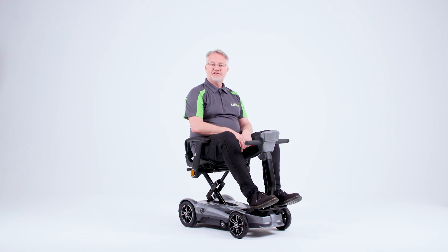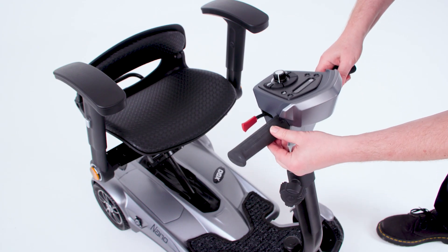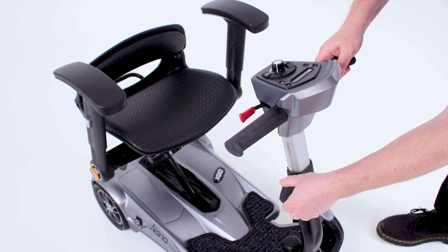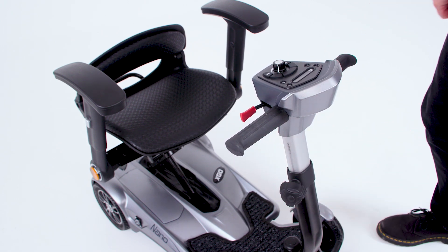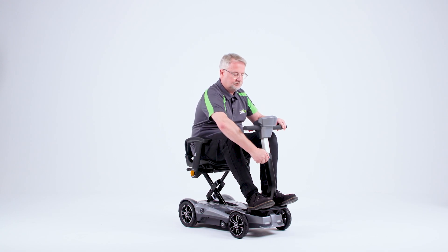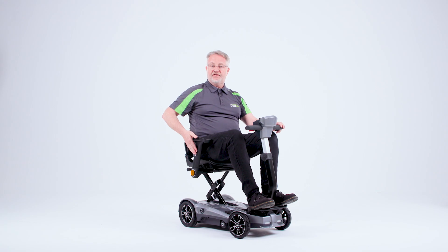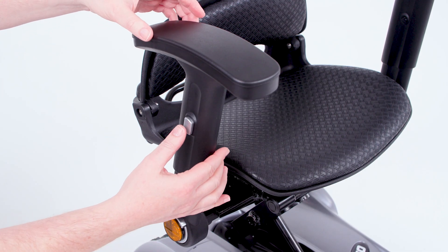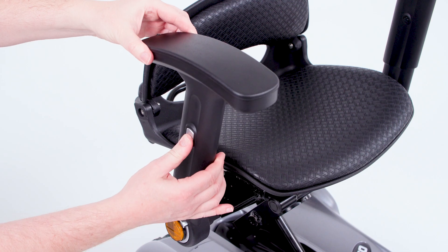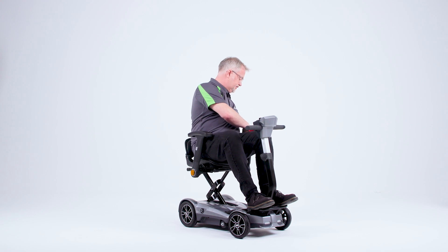With my feet placed as so, I can now adjust the tiller. Simply release the hand wheel on the front, lift into position and re-tighten. For further comfort, I can adjust the armrest height — there's a button on the side and I press that in and I can adjust those up or down to suit myself. Same on the other side. And I'm now at a comfortable position.